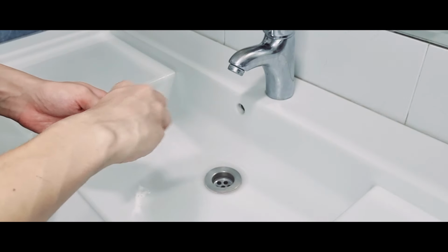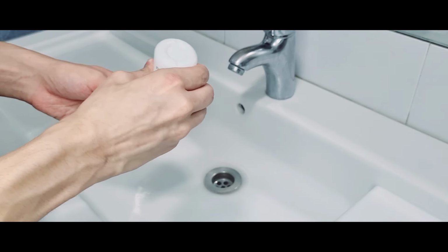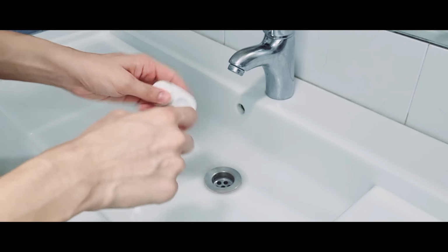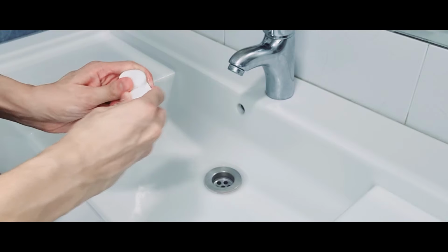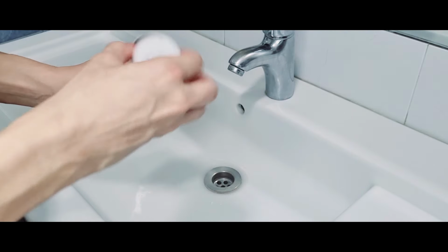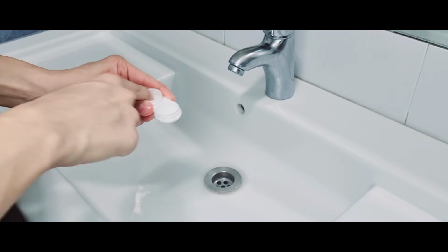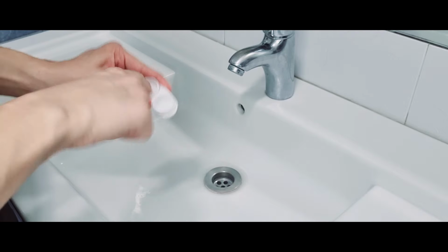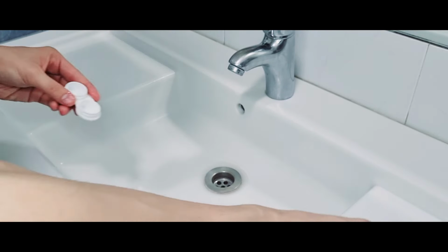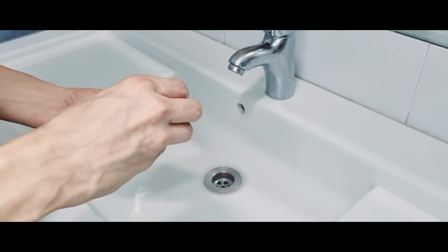The second thing, or the most important thing I want to talk about, is cleaning your contact lens case. So I was with a friend, and he was about to put his contacts back in, and when he opened it, the case was full of dirt and everything. There was hair inside his contact lens box, and the thing he was saying was, I change the solution every single day. Changing the solution every single day is important and a good habit, and it's a must thing to do, but still cleaning the case is really important.